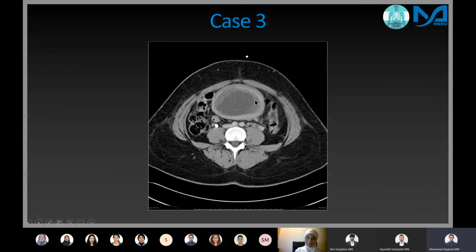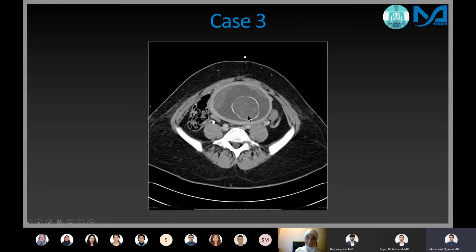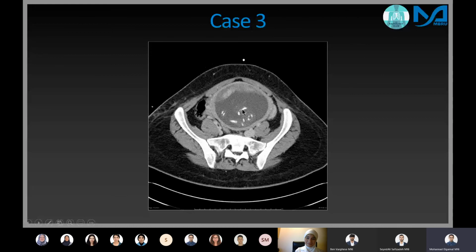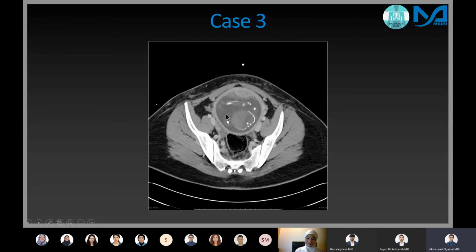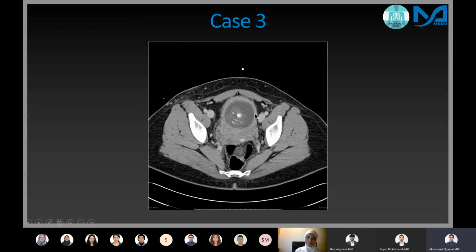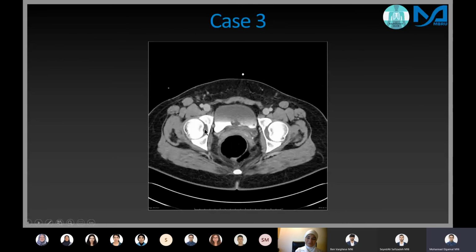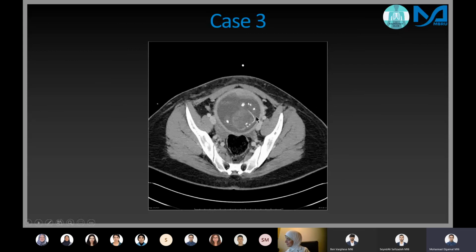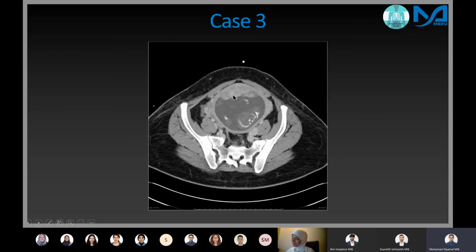Here we start seeing the uterus, and right now we start seeing the skull of the fetus. As we go down, we can follow the bone structure of the fetus. We've got the rib cage, the tibia and fibula over here, and you can see the femoral heads. There's no femoral dislocation, which is a very common injury during road traffic accidents. But let's focus more on the placenta.